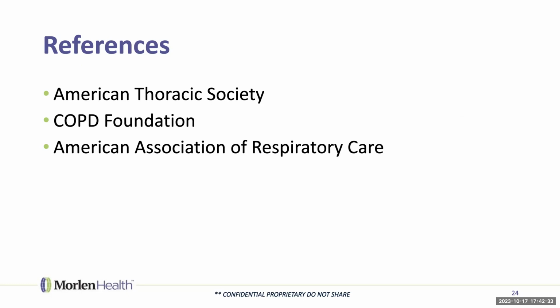The nebulizer is used in hospitals partly because of tradition, partly because it's more difficult to teach people how to use the other devices effectively in an emergency situation, when you come into the emergency room. But you may want to have a nebulizer available if you're using that kind of medication for when you're having an exacerbation of your underlying chronic respiratory disease, pulmonary disease. But whatever feels best to you is best for you. Okay.